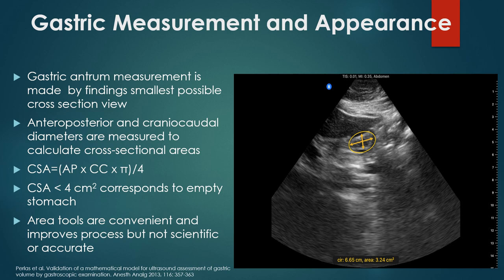Area tools are very convenient and improve process and flow, but are not very scientific or accurate. But at the same time, those of us that are in very busy practices are often not necessarily cutting corners, but we're using the fastest processing capability that we can think of.